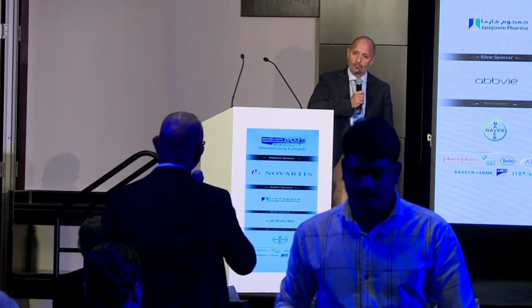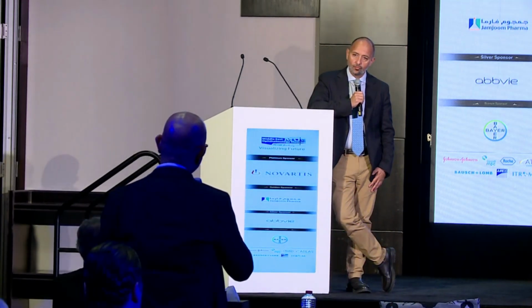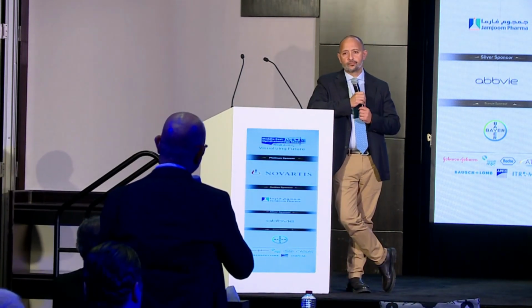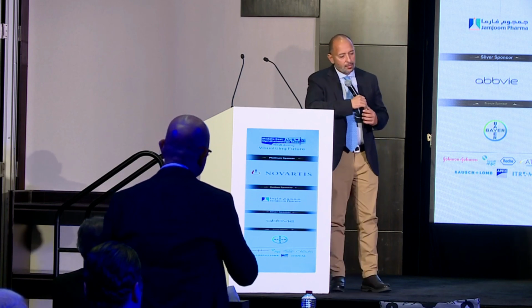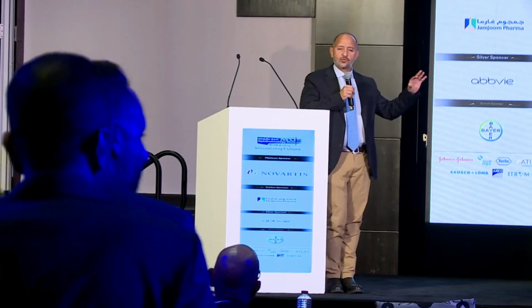What is the role of using scrapers dipped in alcohol to remove epithelial ingrowth? Do you think that is going to have any impact? Yes, you can do this, but for patients not like this one. This was an end-stage epithelial ingrowth. And when you get a summary of the case from the patient, some details will be missing because he's not an ophthalmologist.